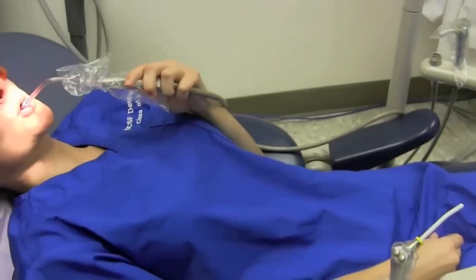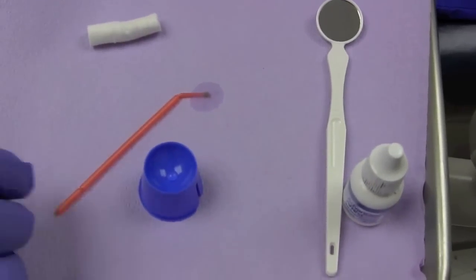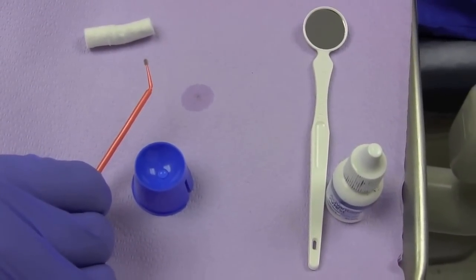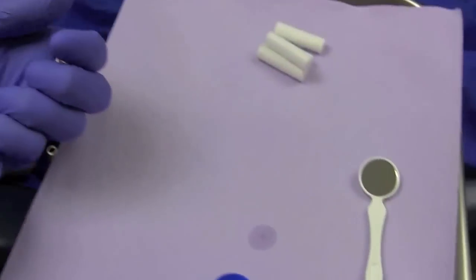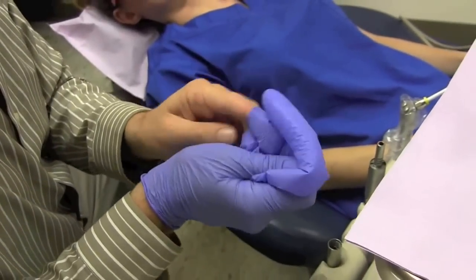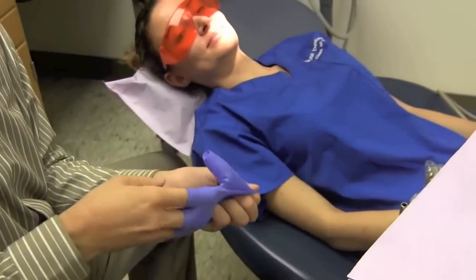So lastly, I'd just like you to see that we have a plastic lined tray cover, so the silver stain, which you can see the brush is already starting to stain, doesn't get onto our counter surfaces. We like to take the materials and wrap them up in our gloves, like so, to decrease the chance of stain.